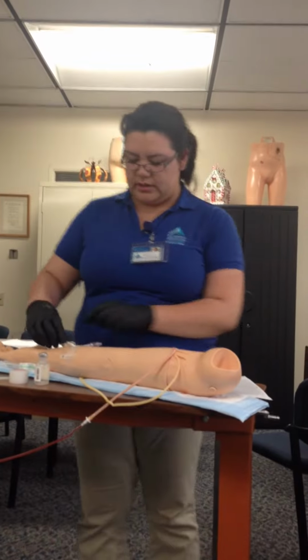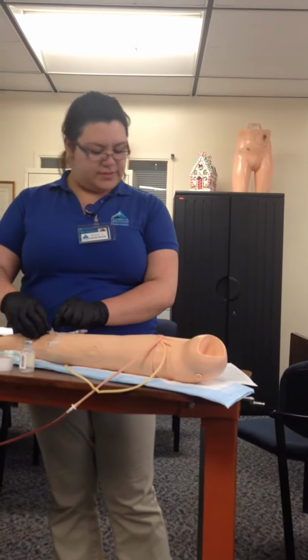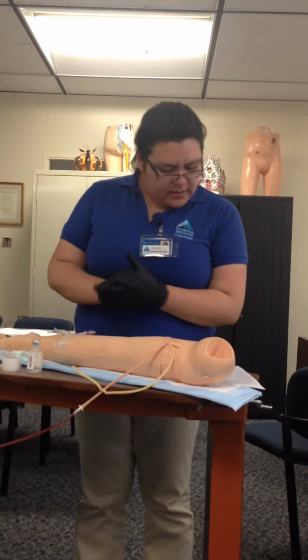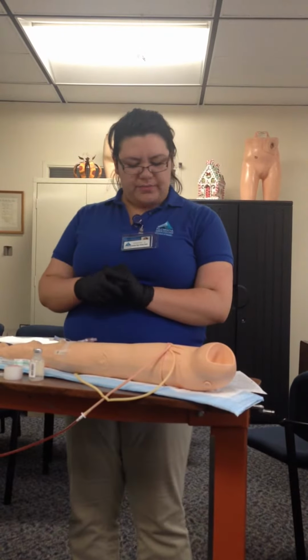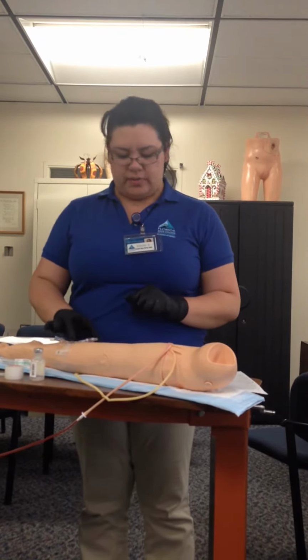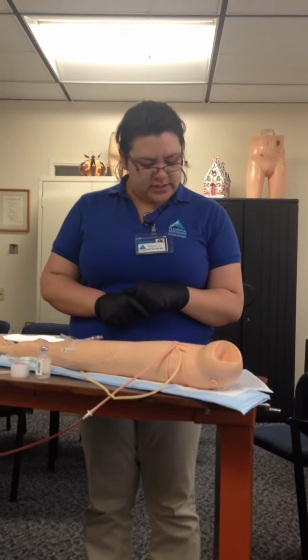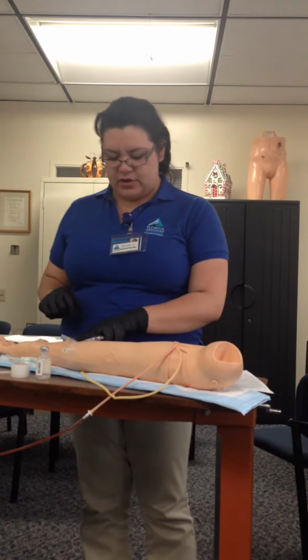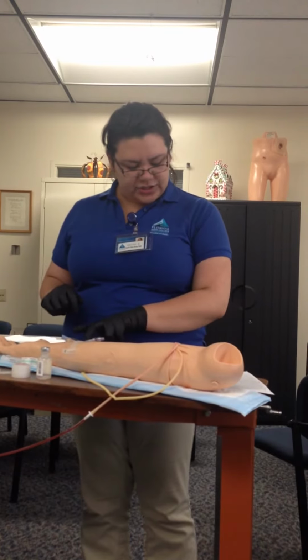No, I'm supposed to clamp. I was supposed to clamp. And then the H of ASASH is only used when heparin is used to flush a central line or a PICC line. And I would dispose of all my needles and syringes in the sharps container. And I would monitor the site for edema, pain, tenderness, and any allergic reactions.